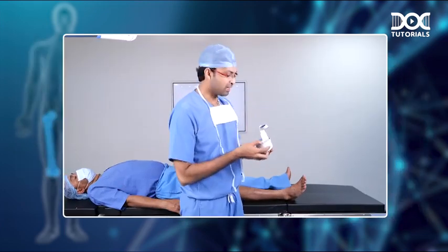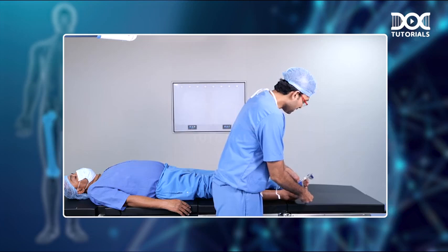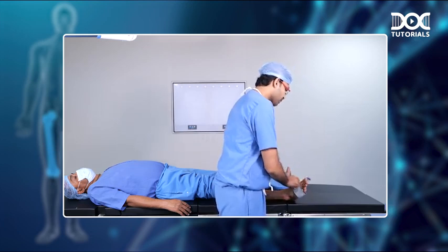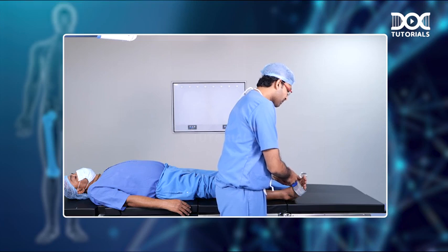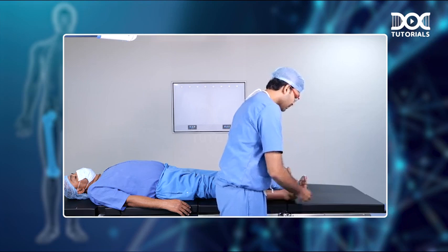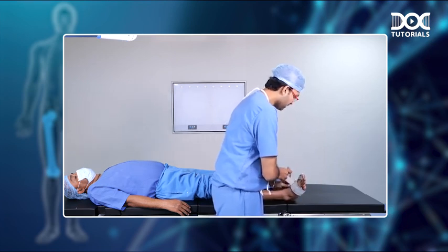What you do is that you slide the splint like this. Make sure that the plastic elongated area is on the medial aspect of the foot like this, and this depression on the splint should rest on the bunion. Once you do that, you put this around the big toe and tighten it. All of these are Velcro straps. You can tighten it or loosen it as much as you want. Then you tighten the strap around the foot as well.